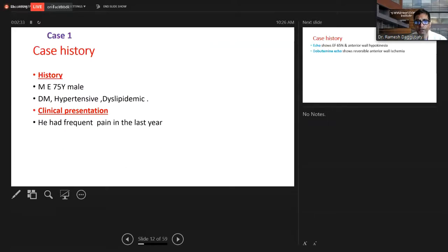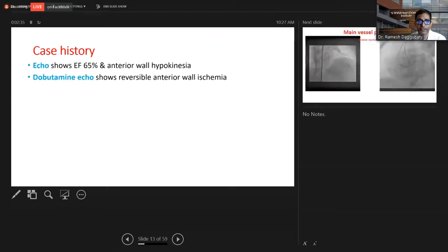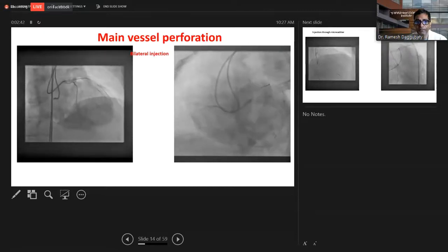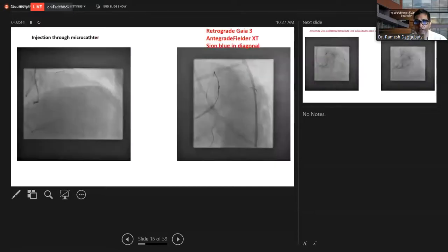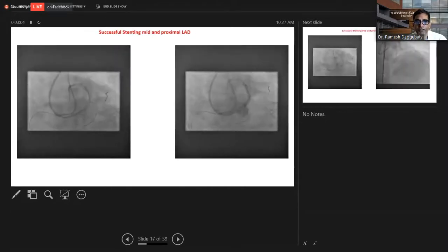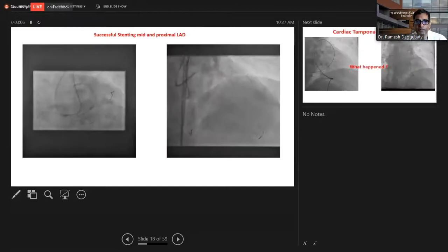So here is a 75-year-old man with angina and anterior wall hypokinesia and ischemia on the stress test, who comes in, and as you see, this LAD is being supplied by collaterals from the right. It's typical, as we have seen the great presenters prior to me talking about both antegrade and retrograde approaches. The CTO was performed very well with the retrograde approach, as well as there is a wire antegrade in the diagonal and the circumflex as well. Then the mid to proximal LAD was successfully stented.